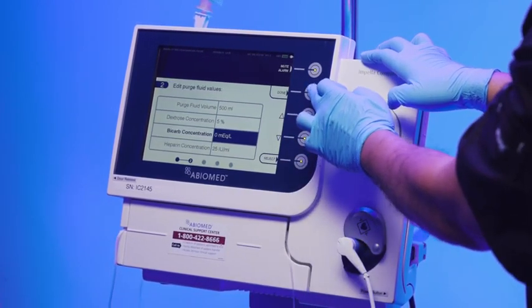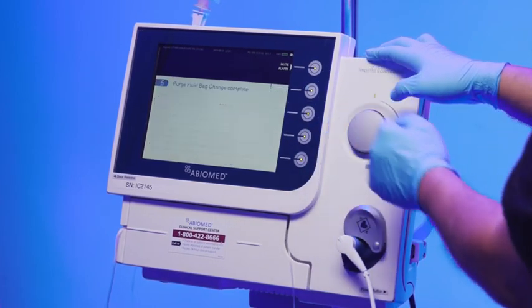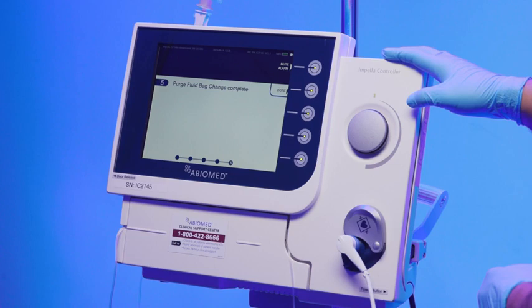The AIC will move to the prime Impella screen. The instructions to disconnect the lure and to automatically prime the tubing only occurs if the user changed the purge fluid concentration.